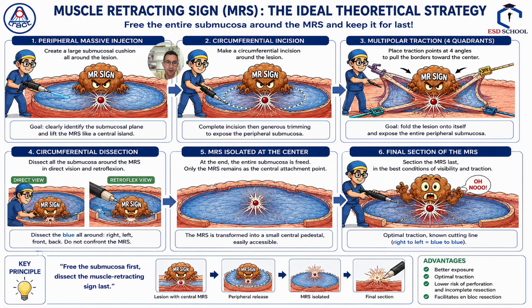I don't know, but for me it is still more logical to try to remove all the blue layer around, track the four edges of the lesion to the opposite side, and finish with this big bleeding at the center of fibrosis, when I see everywhere what remains at the center.